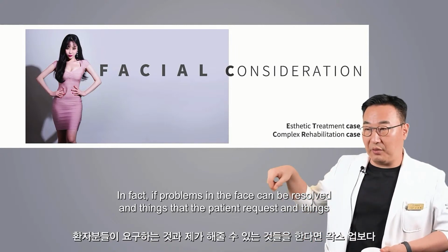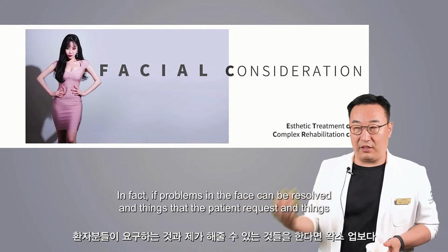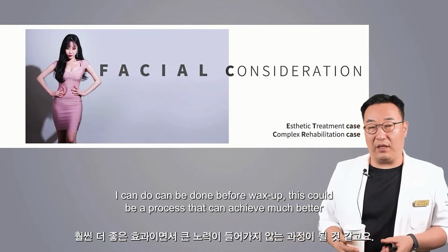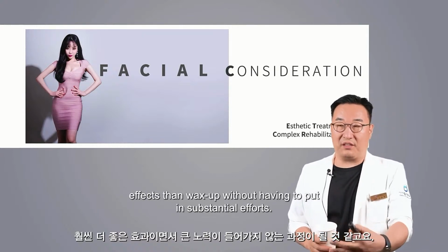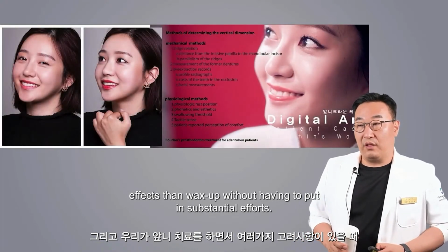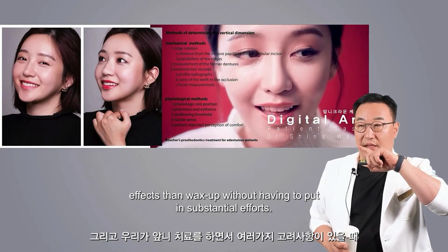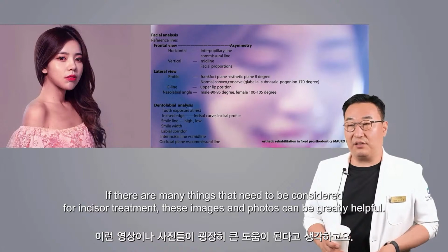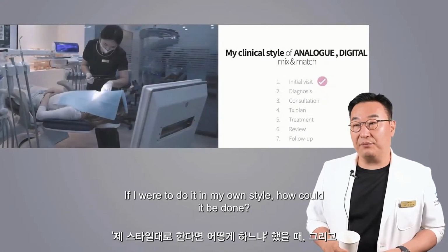In fact, if problems in the face can be resolved, and things that the patient requests and things I can do can be done before wax-up, this could be a process that can achieve much better effects than wax-up, without having to put in substantial efforts. If there are many things that need to be considered for incisor treatment, these images and photos can be greatly helpful.